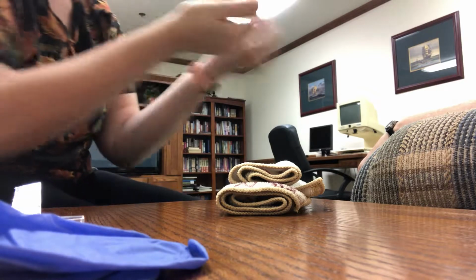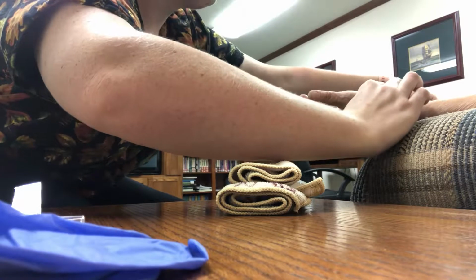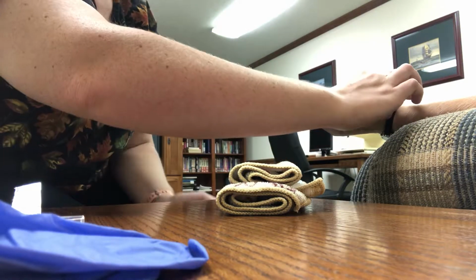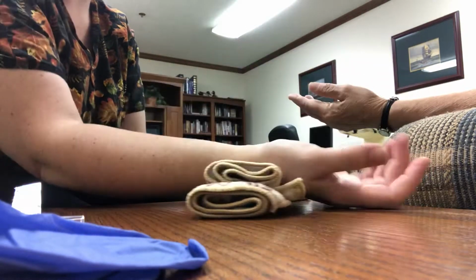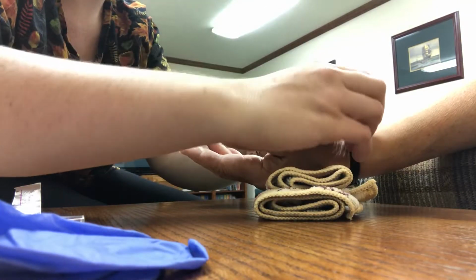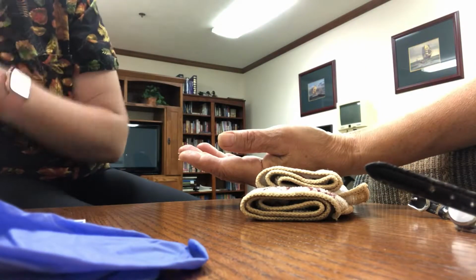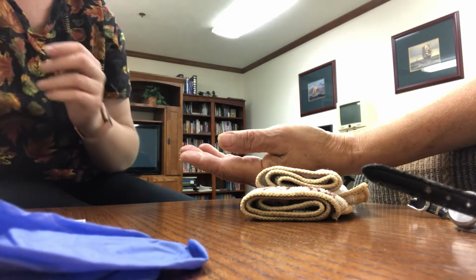Okay, I'm going to have you hold your wrists out like this for me, palm side up on both sides. I'm going to feel which one has the strongest radial pulse, which I think this side does. So what I'm going to have you do is lay your arm on this towel like this with your palm side up. Can I just loosen that? Oh, take it off if you want. Just like that for right now. Okay, so I'm going to go ahead and wash my hands here. I've got everything all set up.